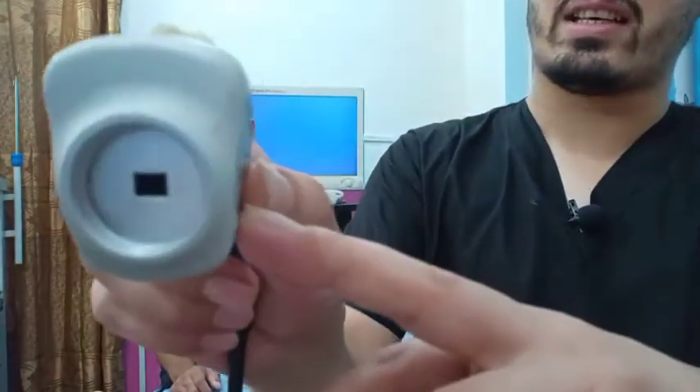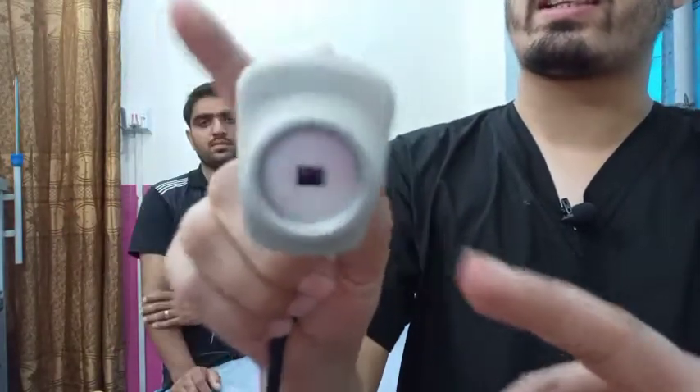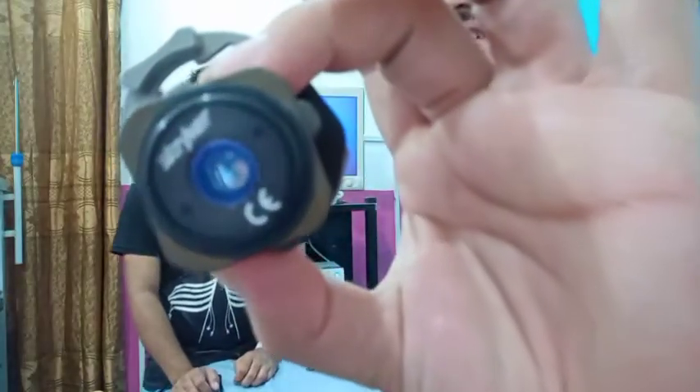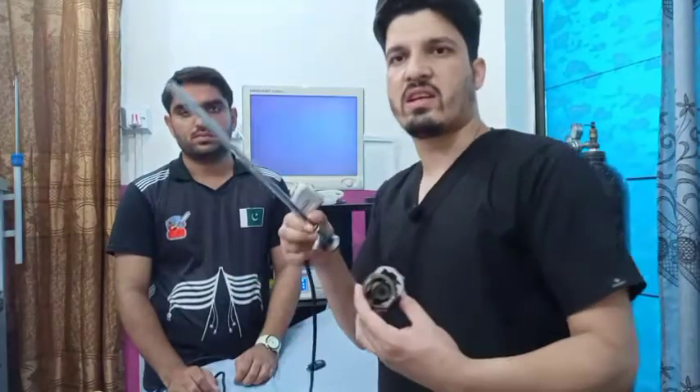The CCD has got the lens, and if you are able to see in a closer view, that greenish chip is there. This is the one-chip camera. This is known as the optical coupler, and if you look closely, on both sides there are lenses. It is known as a coupler because it couples the camera CCD with the telescope.